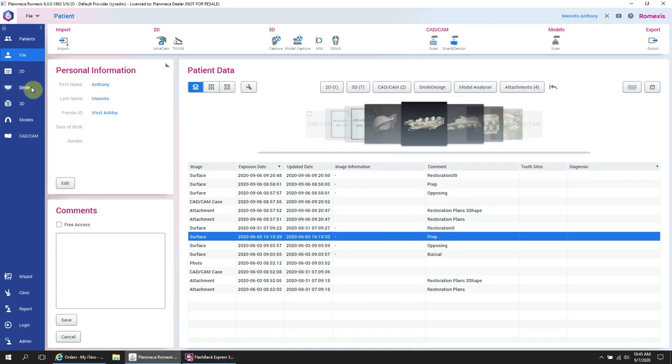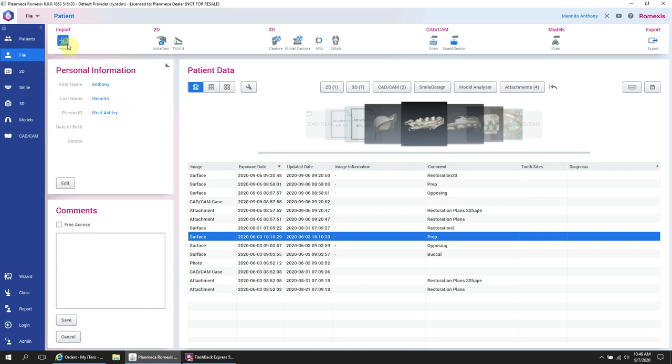This is a very important step. If you don't do this, you will find it very difficult to import. So here we are in Romexis. We have already added a patient. Now we are going to import.